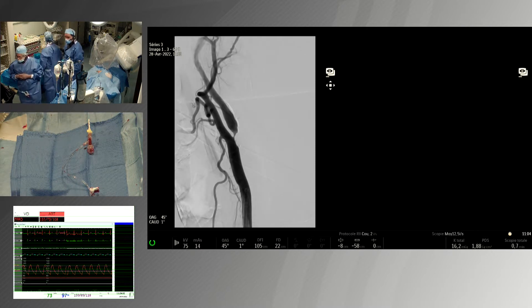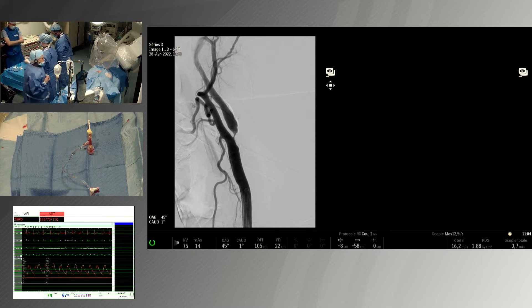We can use the EZ Boston system. We are going to prepare the filter. We are measuring the lesion and the stenosis — it's probably where we will place a three centimeter stent. It's important to prepare the filter in the water.